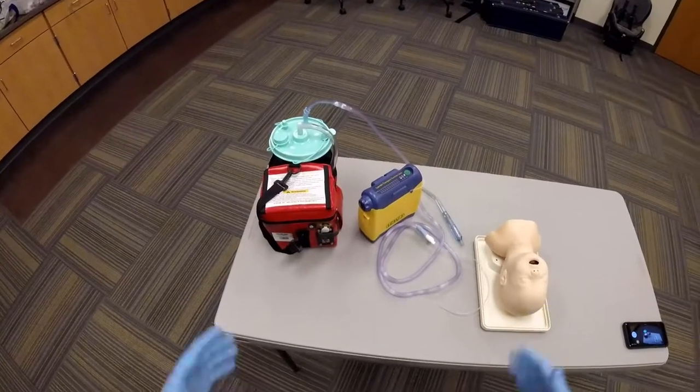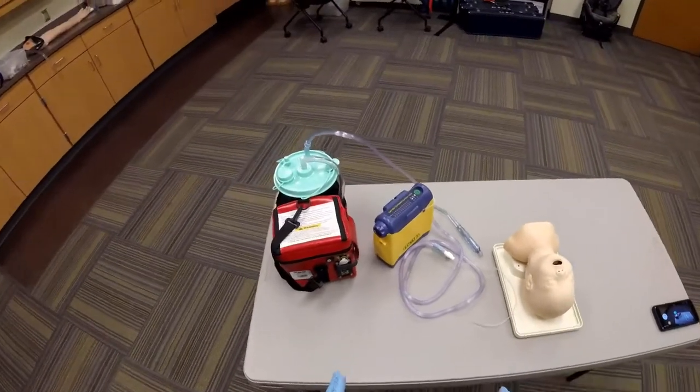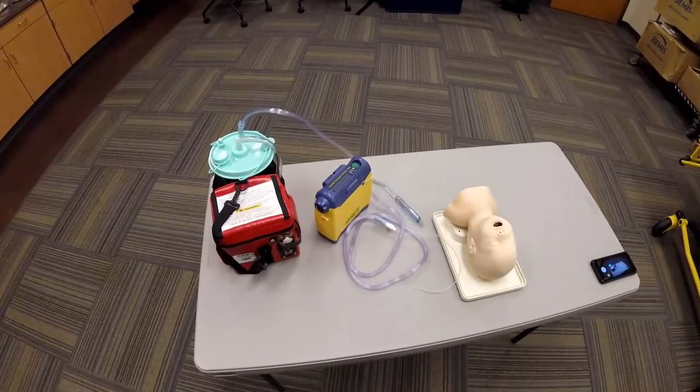Pediatric suctioning. BSI, consider PPE. This is very similar to adult suctioning; however, there are some very important steps you must take.